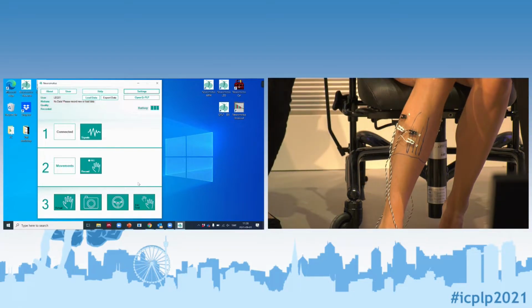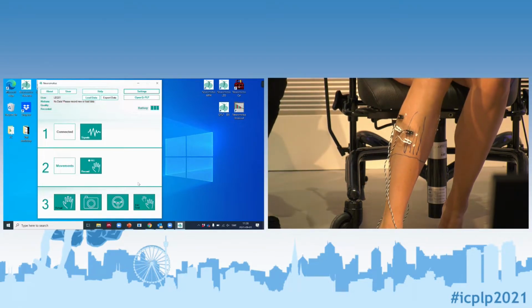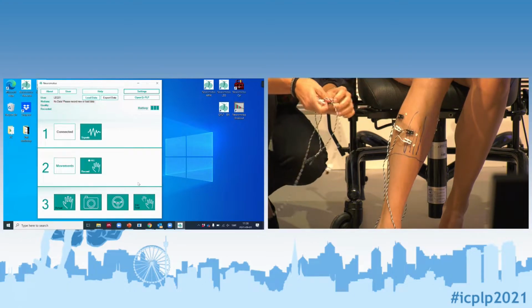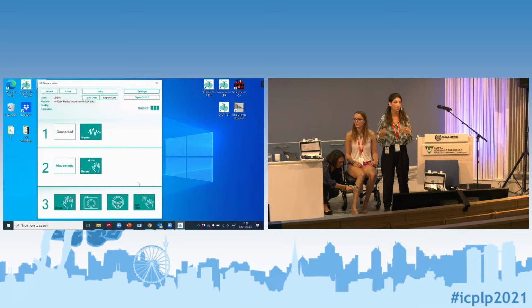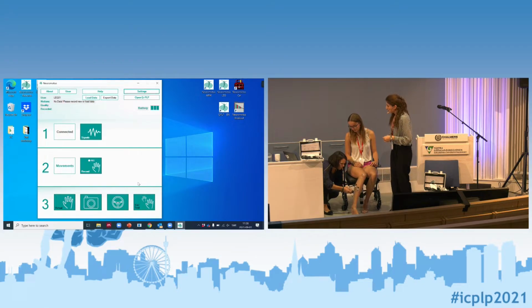One important detail as well, when you place the electrode in the first session, you try to cover as much as possible, so you place as many electrodes as you can. And then while you get to know your patient, you can continue and maybe take pictures or figure out the best way to place the electrodes. Yes, so we have help here with the electrode.